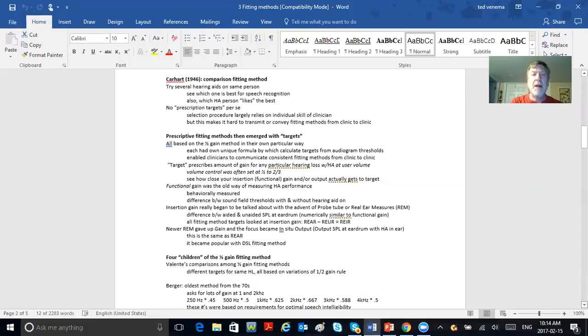Carhart, way back when, had something called the comparison fitting method. He didn't look so much at the thresholds. He was big on speech discrimination. He would choose from a drawer three different hearing aids, and he'd put them on the person. And he'd tweak the frequency response to match, in his head, the degree of the loss. And then he would test speech discrimination. Which one gave the best speech discrimination? And also which one the person liked the best.